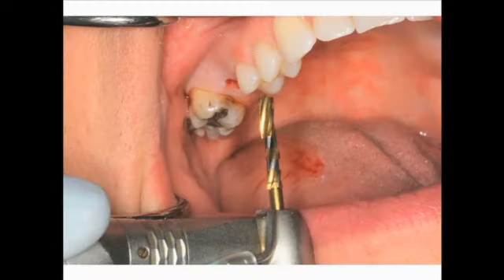We then go to a 3.3 twist drill, and the actual diameter of this drill is only 2.8 millimeters. It's positioned so that an osteotomy 9 millimeters into bone is made. We predetermined using our CT guide that we were going to place a 9 millimeter implant.